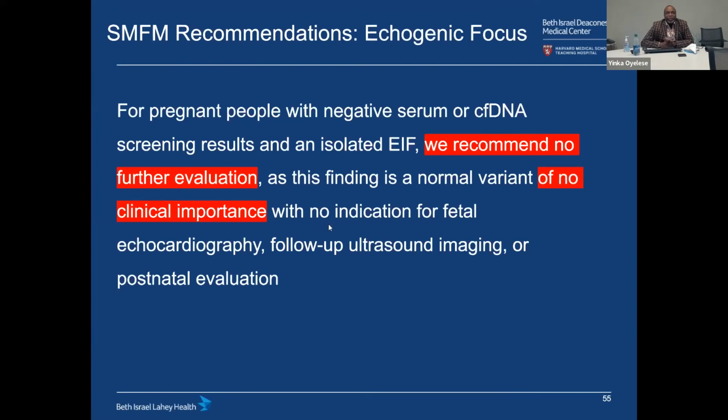And last year, the Society for Maternal Fetal Medicine went again and made a detailed guideline on what to do with soft markers. For pregnant people with negative serum or cell-free DNA screening results and an isolated echogenic focus, we recommend no further evaluation, and I put that in red. This is a normal variant.